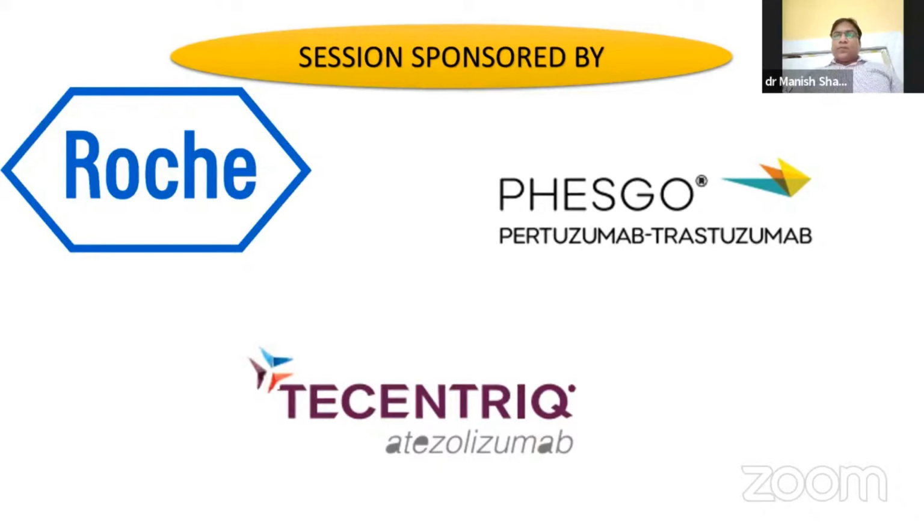And that also helps you in identifying which targeted therapy to look for or to first give. So if you have EGFR as well as ALK, and you have higher frequency of EGFR mutation, the VAF percentage, you target EGFR first, then the ALK, or vice versa, depending on the VAF.